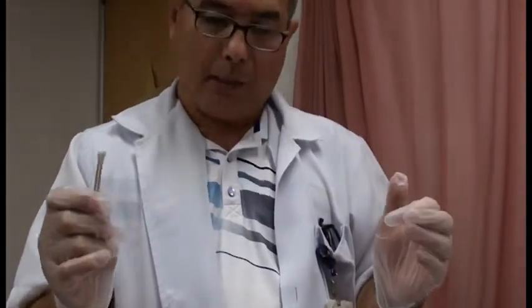If the tracheostomy is a new trach site, and I'm saying that if it's 10 days or less, we need to clean it with saline only. If it's an old trach site, and most of our patients will be, in fact, it'll be an old trach site because they've been in a nursing home, they've been recuperating. We can use the hydrogen peroxide, half-strength hydrogen peroxide to clean the site.